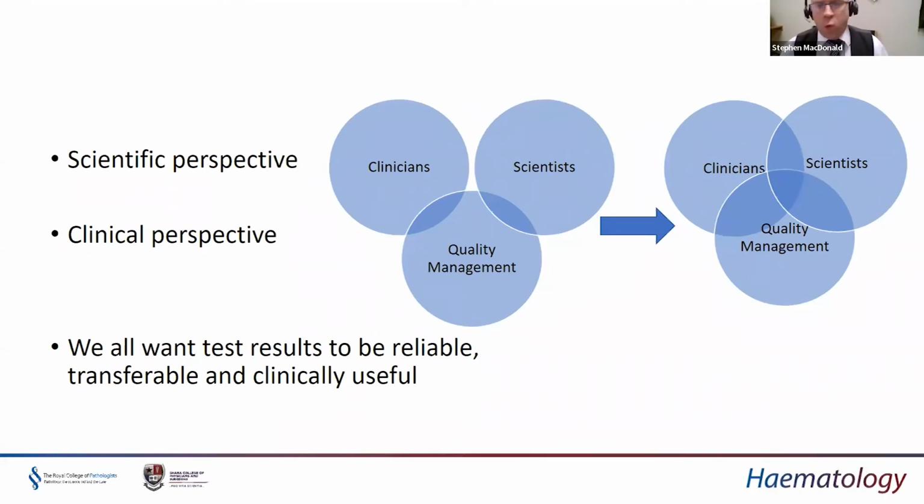And if quality management is our goal in the middle here, then I think over time there has been a separation of the clinical and scientific expectation and management of what is quality management and quality provision, that I think is definitely moving towards what we're seeing in the right-hand Venn diagram, where the overlap is much more substantial, and we're seeing a much more synergistic effect of the interaction between the clinical and laboratorian colleagues, so that the quality management system is being pushed up. The standards are being raised so much more significantly now.